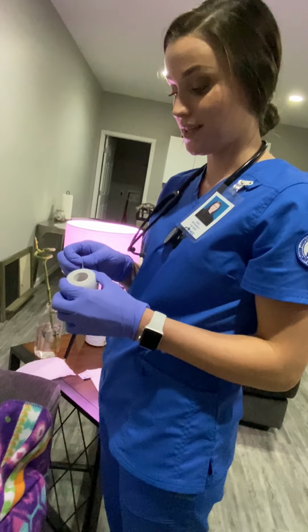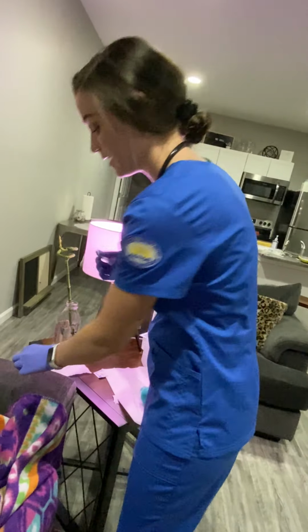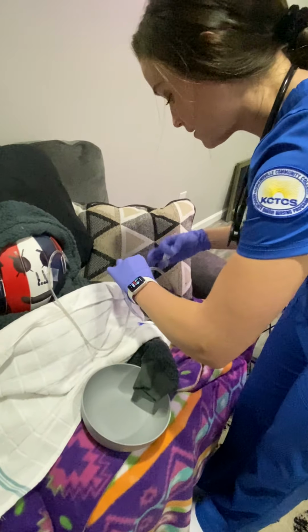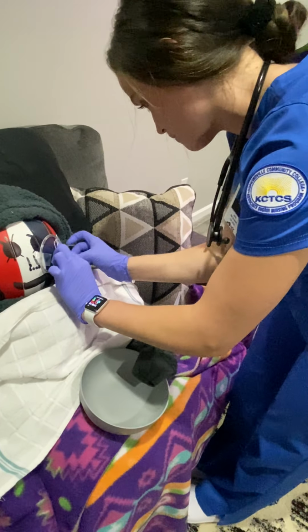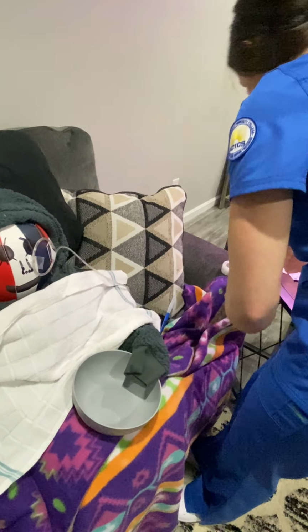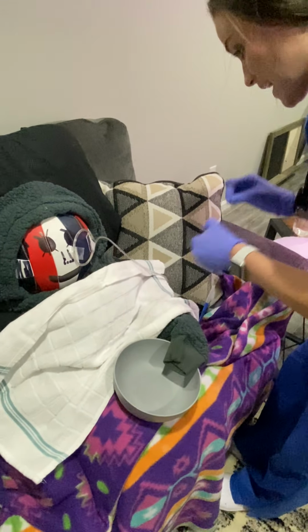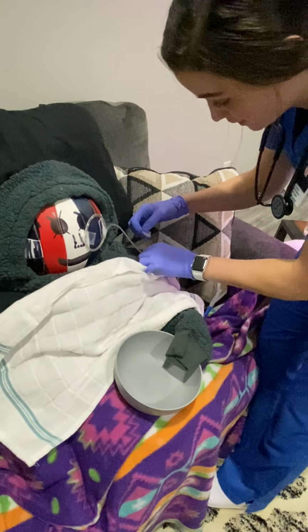secure the NG tube better to my patient so that it doesn't come out of place. So I can secure this on the cheek so it's out of her eyesight. That promotes better comfort. And then also I will tape it to her gown. And I could use Tegaderm as well for the securing of the tube.